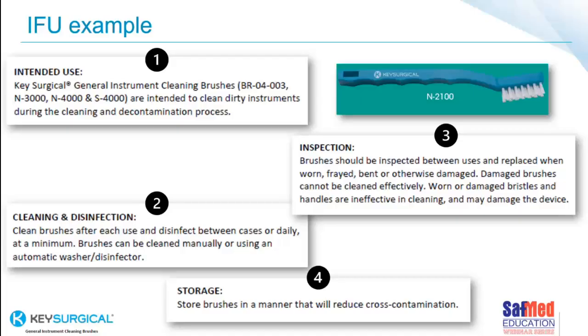So here is an example of an instructions for use from a device for a brush that is designed to clean medical instruments. It clearly states what the intended use is: intended to clean dirty instruments during the cleaning and decontamination process. Not intended to clean your teeth, not intended to clean baby bottles. It's intended to clean instruments and devices.